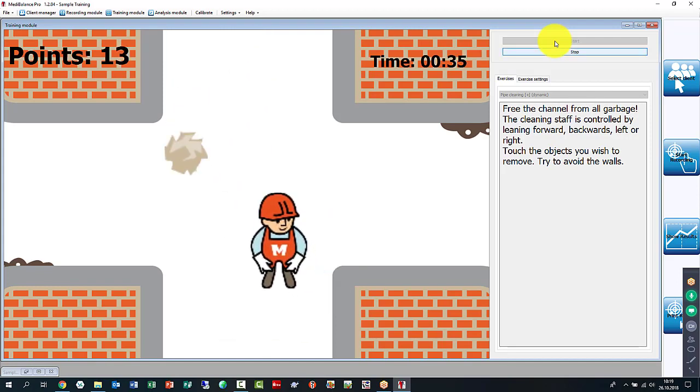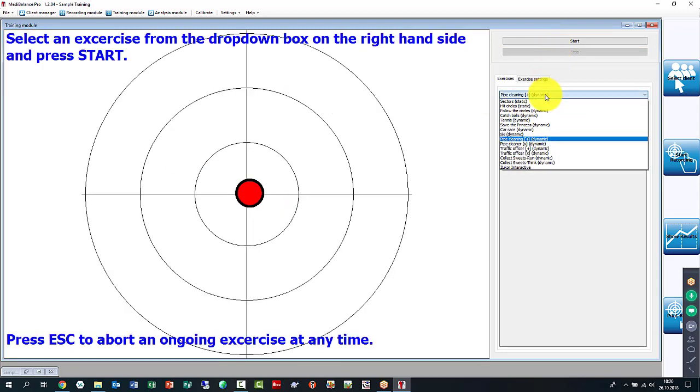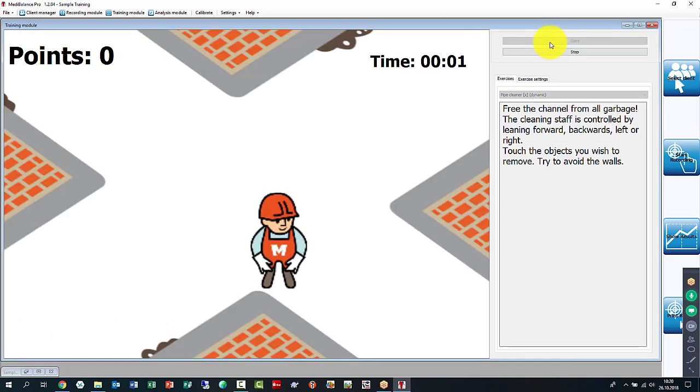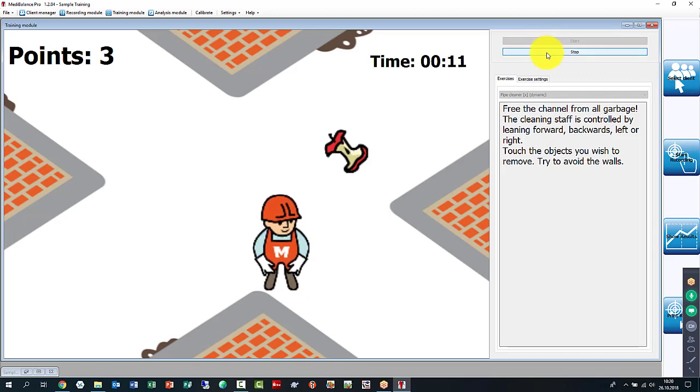And we don't just have this as a front, back, left, right scenario, which is still fairly easy. But the next difficulty level is to do this as an X, as a cross. So now I don't just go forward, backward, but I have to go forward and right, backward and left, and to collect the items at hand. Now this is the easy level.